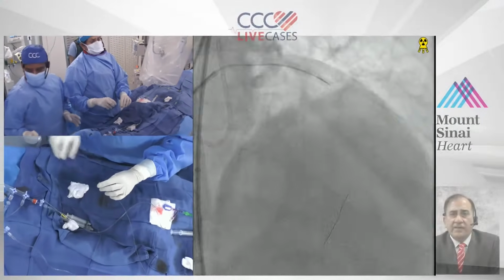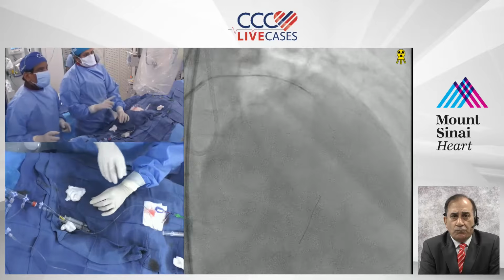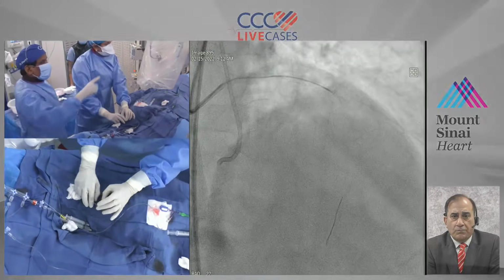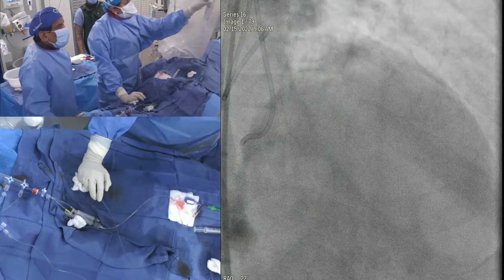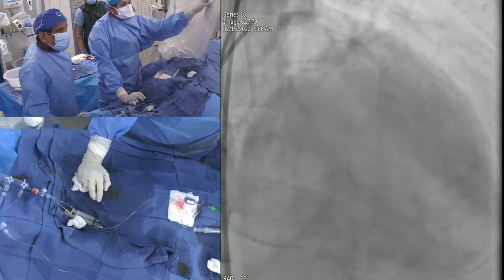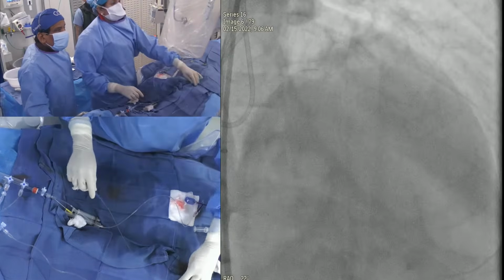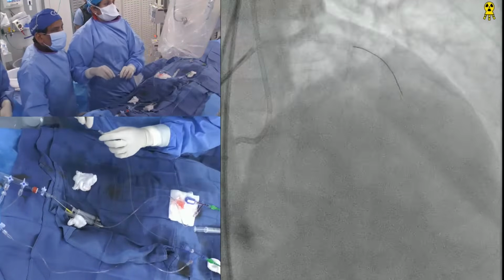I think the Corsair is definitely not advancing. Let's try the proximal. If you have two issues, that is not going. See which one else is there. None probably. I'll try again proximal.